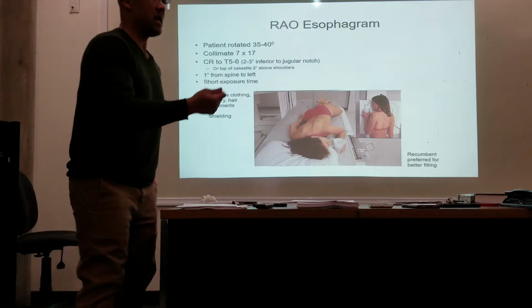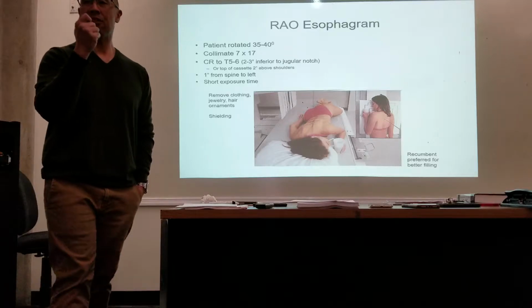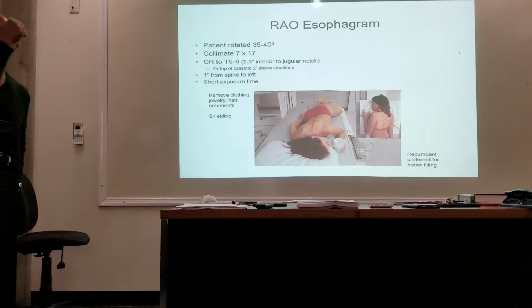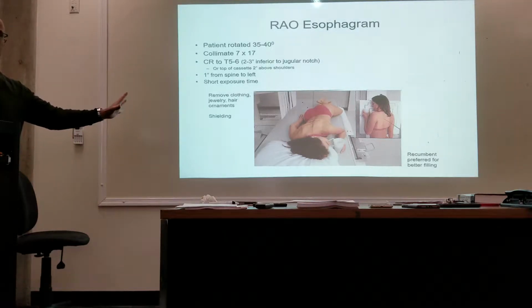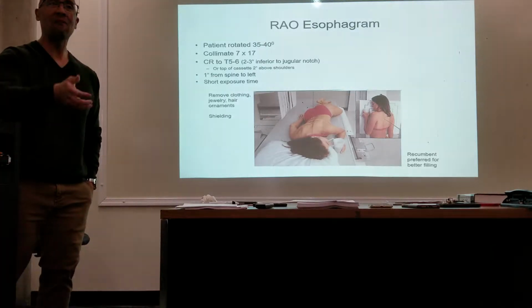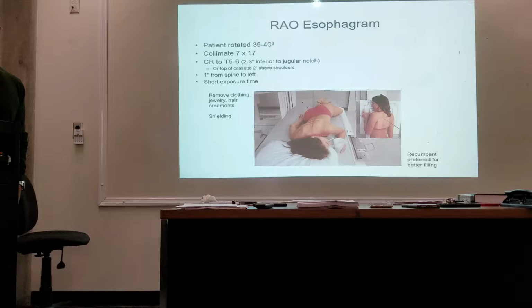They are going to take 3 spoonfuls of the thick barium, okay, and on the 3rd swallow, you're going to step out of the room and you're going to tell them to hold their breath and then hit the switch. Okay? Drinking, there is no holding of the breath. The thicker barium, you're going to have them hold their breath. And on the 3rd swallow, you're going to be back there and you're going to hit that switch. Okay, it's going to be done immediately.